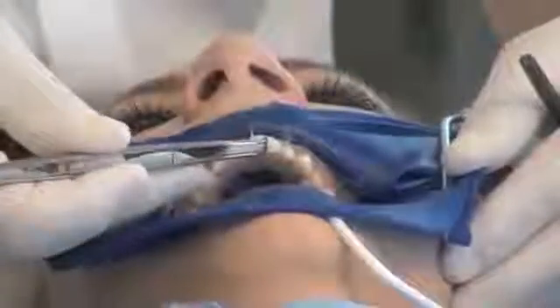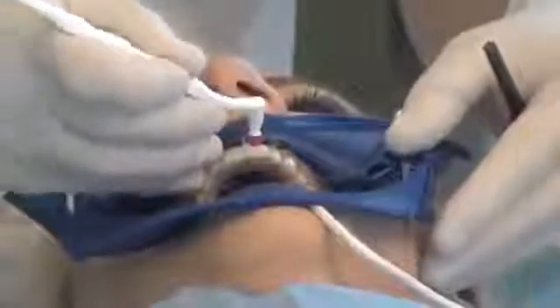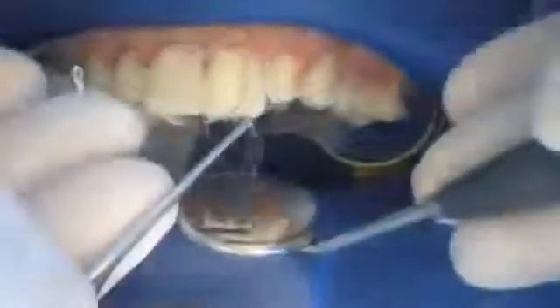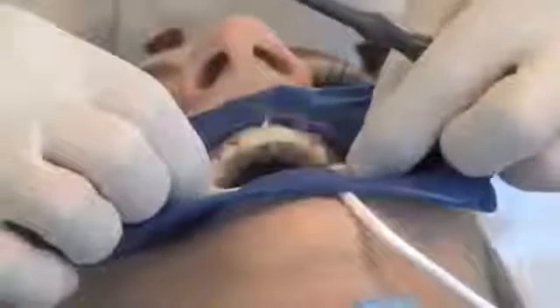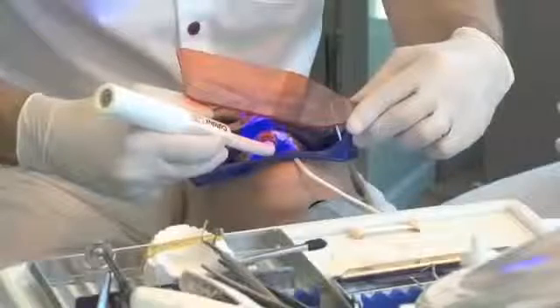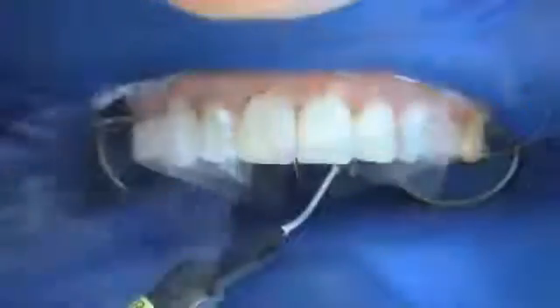When placing several COMPONEERs, it is recommended that the first COMPONEER should not be light cured. The second COMPONEER is placed in the same way as the first and aligned to the first. The position of the COMPONEERs is checked or corrected using the occlusion index that has been prepared. With the COMPONEERs in the correct position, the COMPONEERs are light cured, firstly palatally and then buccally, each for 30 seconds. Further COMPONEERs follow in the same fashion.